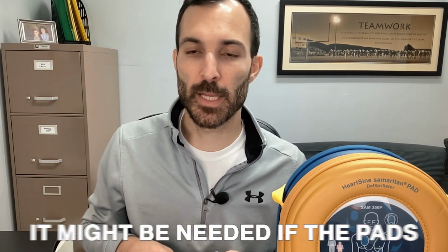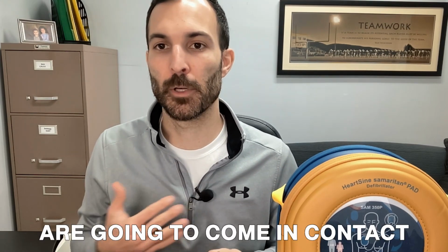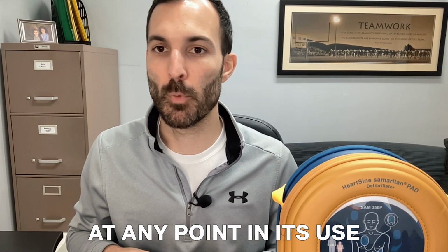Second thing is if the pads come in direct contact with any kind of wiring. So when you think of wiring, think undergarments, things like that. Maybe not always necessary to fully remove undergarments or underclothing to place the pads, but again, it might be needed if the pads are going to come in contact at any point in its use.